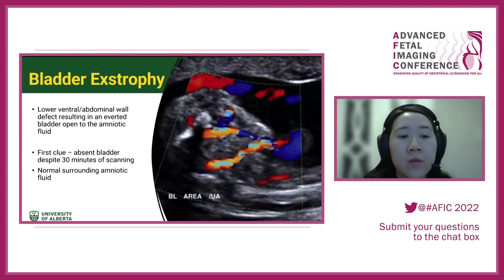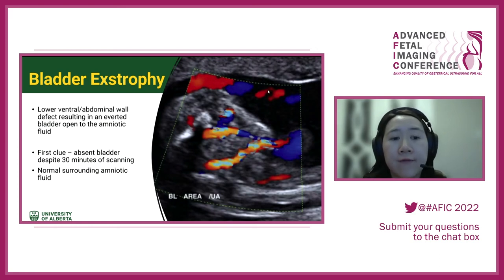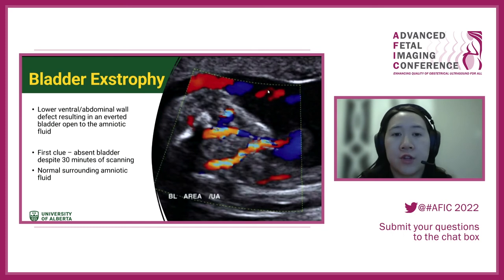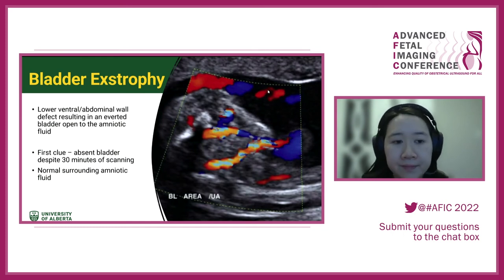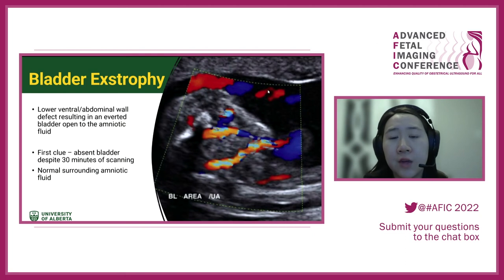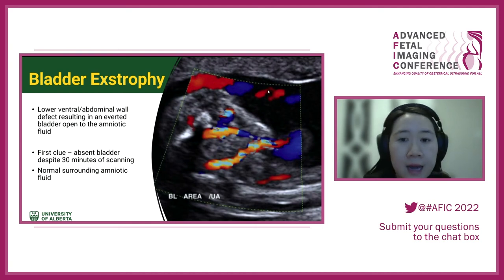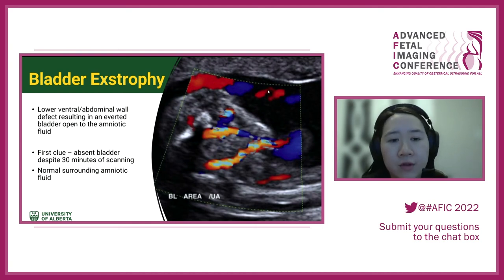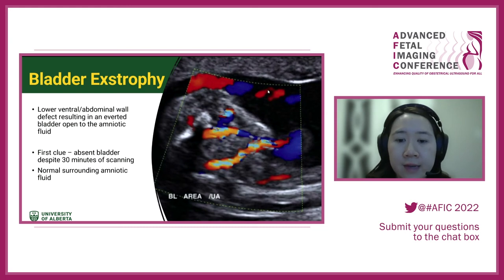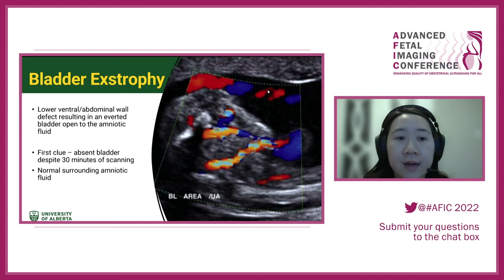With bladder exstrophy, we're looking for a lower or ventral abdominal wall defect resulting in an everted bladder — essentially open to the amniotic fluid. The first thing you should notice is that you cannot find the bladder. Looking at the coronal view, you cannot identify a full bladder even though fluid is still normal.